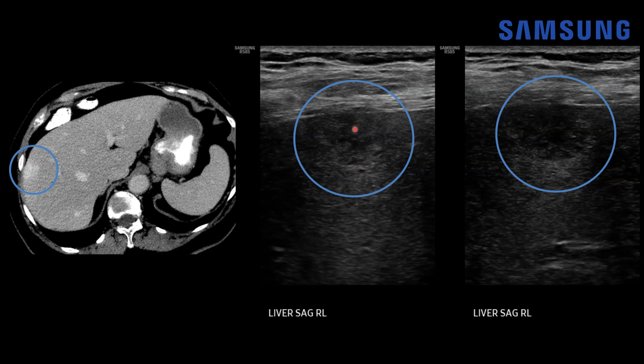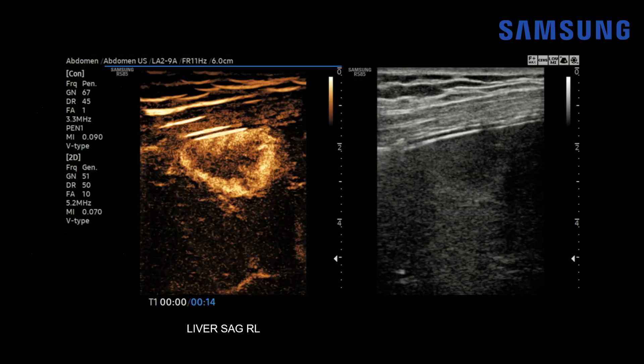This finding is somewhat indeterminate, as hemangiomas are often diffusely echogenic on ultrasound. But hemangiomas can sometimes have a reverse target appearance where they're centrally hypoechoic and peripherally echogenic. We would still need to work this up further in a patient with a new primary malignancy, so a contrast ultrasound was done.